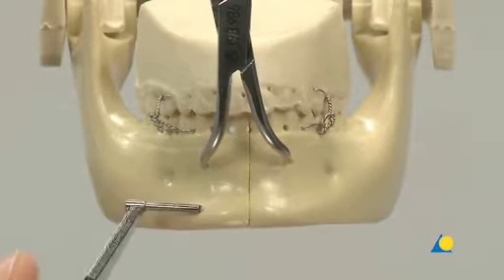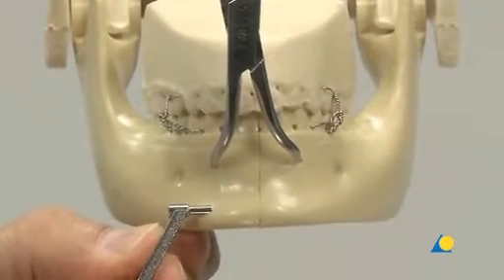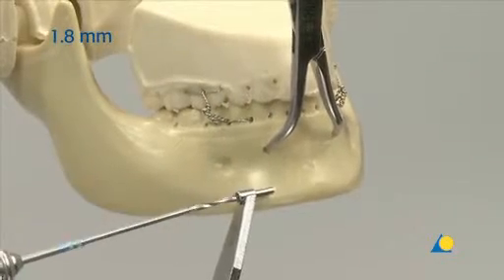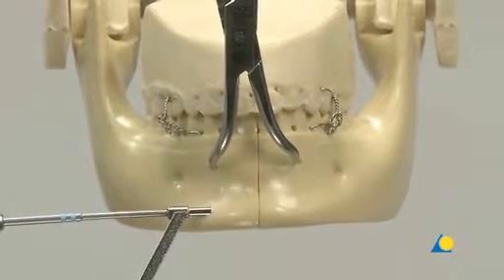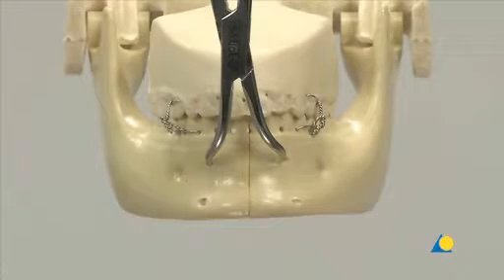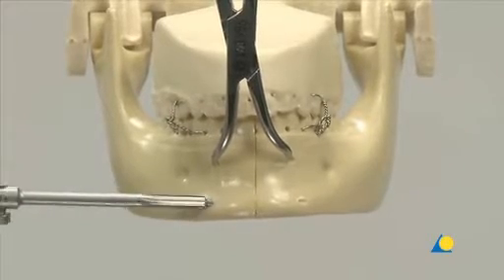Next, a thread hole is drilled. The 1.8mm drill guide is placed into the glide hole, and using a long 1.8mm drill bit, drilling is continued through the far cortex. Counter-sinking is done by hand, taking care not to counter-sink too deeply to avoid removing the cortical bone buttress.